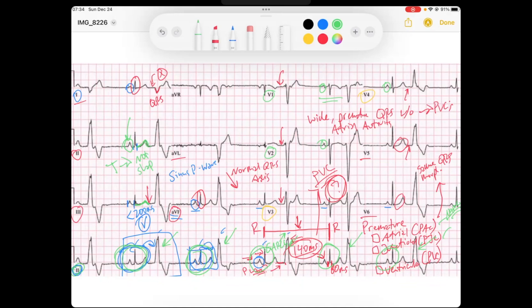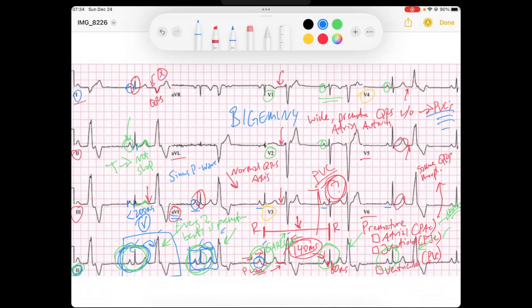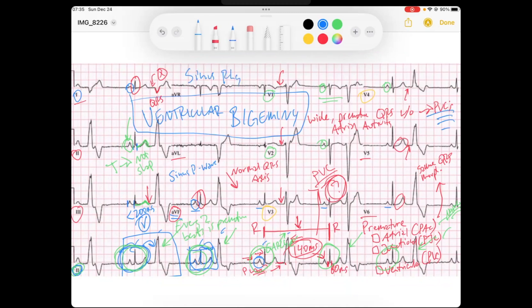When a premature beat occurs every two beats — every other beat is premature — this is called bigeminy. And because these are PVCs, this is ventricular bigeminy. So this is a sinus rhythm with ventricular bigeminy. I hope you enjoyed that, and have a great day. Thanks for joining us.